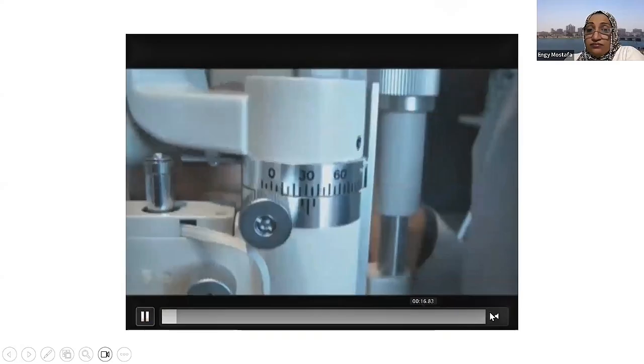I think this is the main idea of the optical section, so that you want to know how deep your ulcer is. Is it only in the anterior parts of the cornea? Is it epithelial only? Is it going through the stroma? It's the main job of optical section, as I know it.